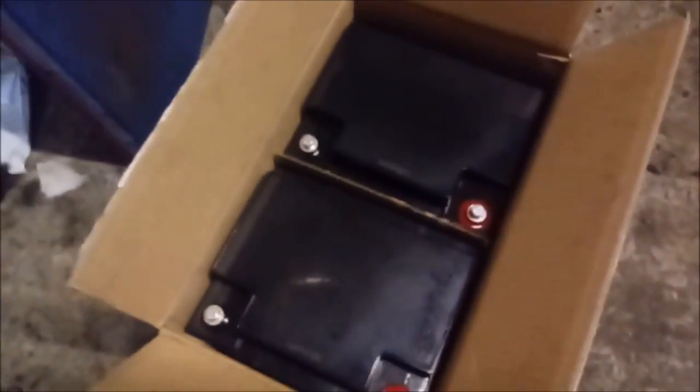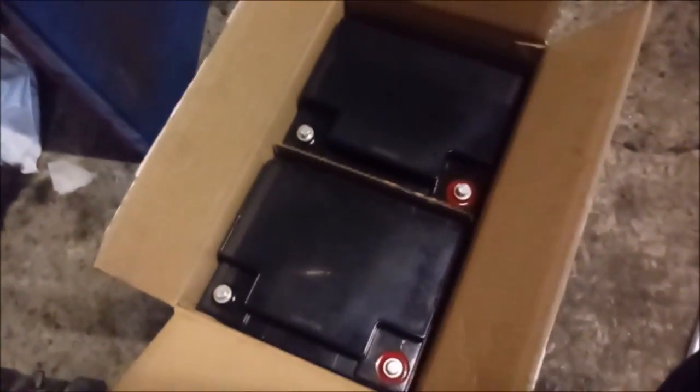So he's bought himself a pair of nice new batteries. So our job for today is to fit them in, and the batteries are located under here. You've got the motor and the axle under there, and the batteries that sit side by side under the seat. So let's see what we can get apart.